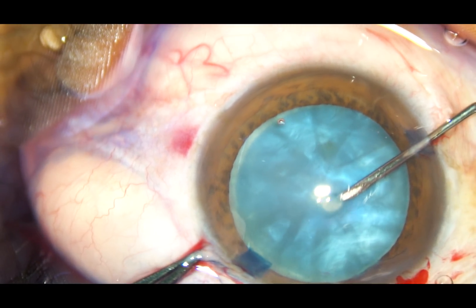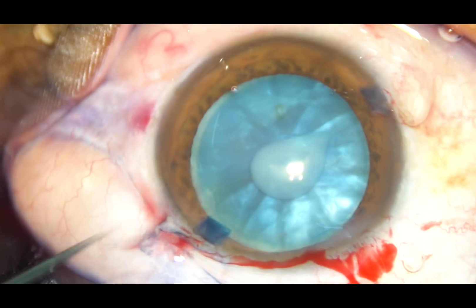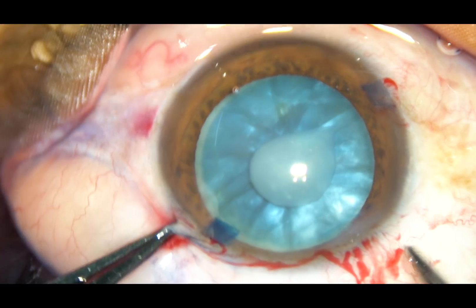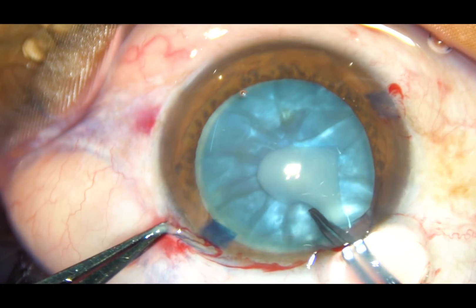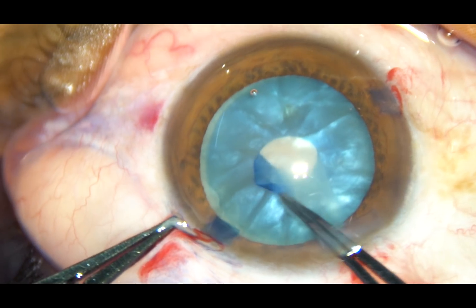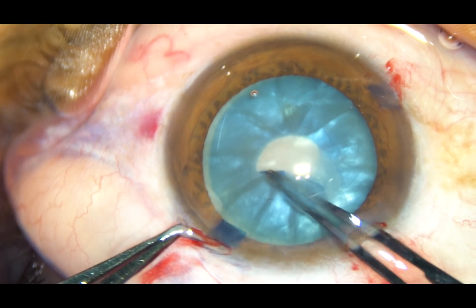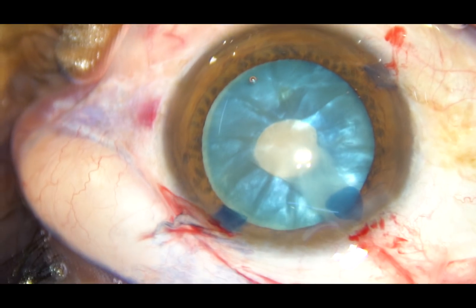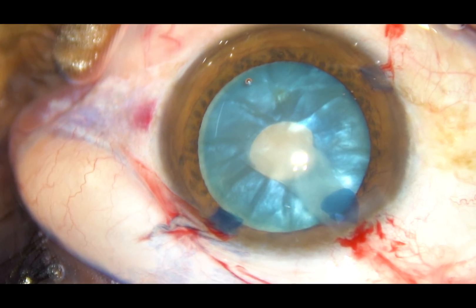Just make a small C-flap at the anterior pole. You can see that white fluid comes out, indicating high intralenticular pressure. And this C-flap is converted into a small rhexis immediately.